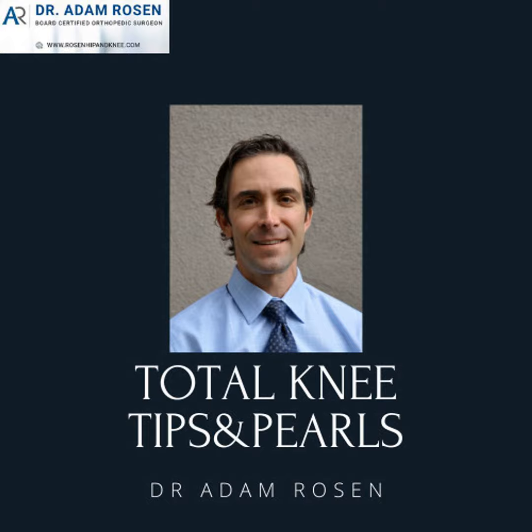Now 2B. So again, T2B or F2B. This is metaphyseal bone damage of both condyles. So both sides of the femur, medial and lateral, both sides of the plateau, medial and lateral are involved. And again, depending on the bone, if it's contained, you might just fill it with cement, depending on the person, their age, their bone quality, their activity level. More commonly, as opposed to impaction grafting, most likely in this day and age you're going to put in larger augments, larger cones, larger sleeves.